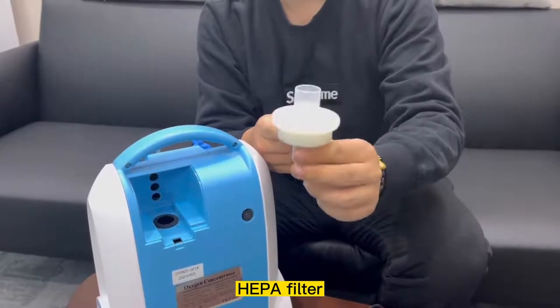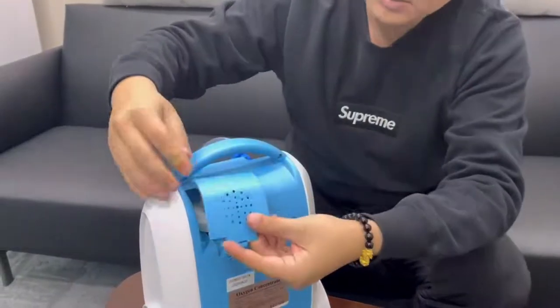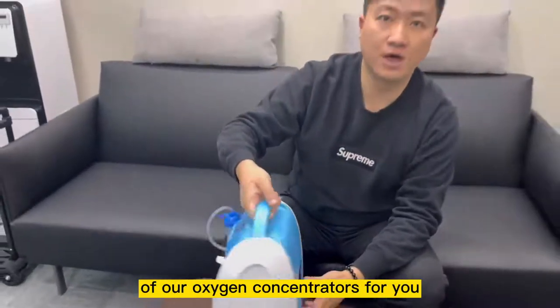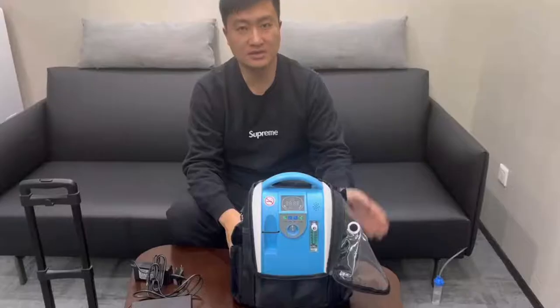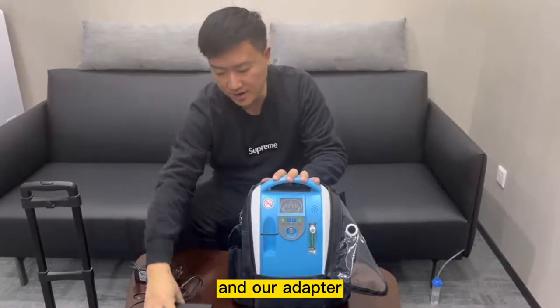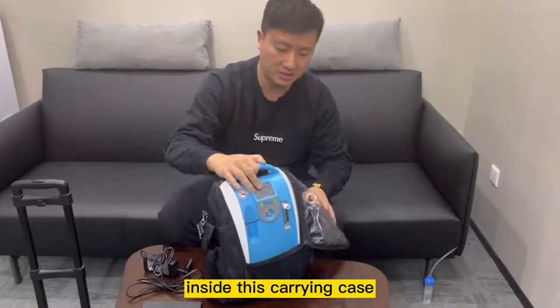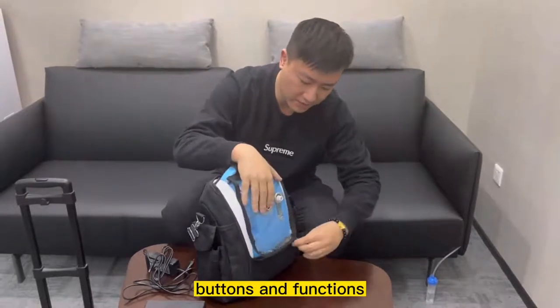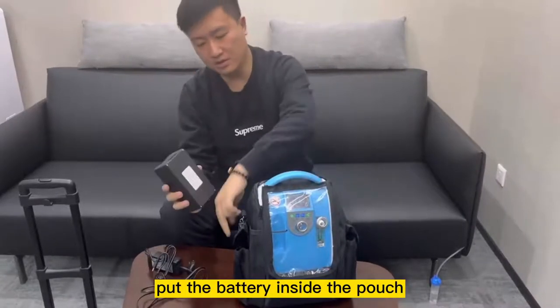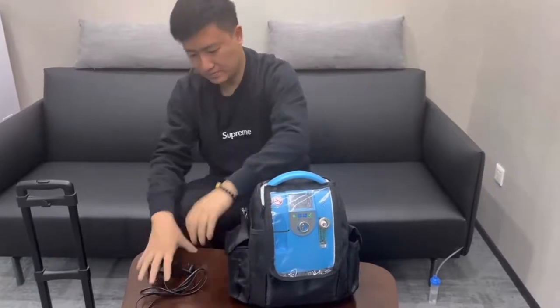You can purchase our second HEPA filter from our shop. Just put it back in. This is our simple maintenance of our oxygen concentrators. And of course, our OLB-B1 model can be used on the go as well. We can actually provide you with our battery and our adapters, and of course our carrying case. We can just place our oxygen concentrators inside this carrying case and close it up. Make sure that all the buttons and functions are aligned together. And you can just put in the included batteries inside the pouch, and the adapters at the other side.